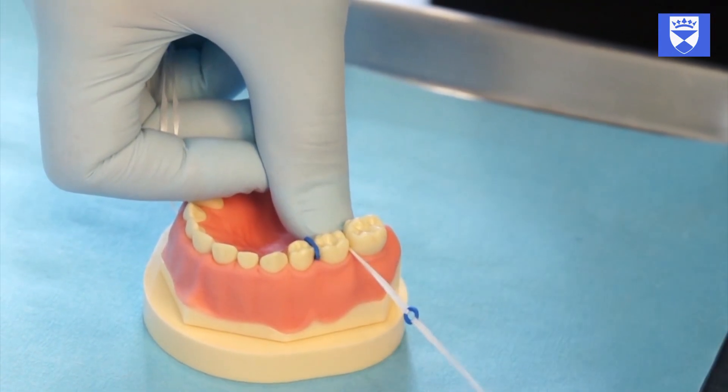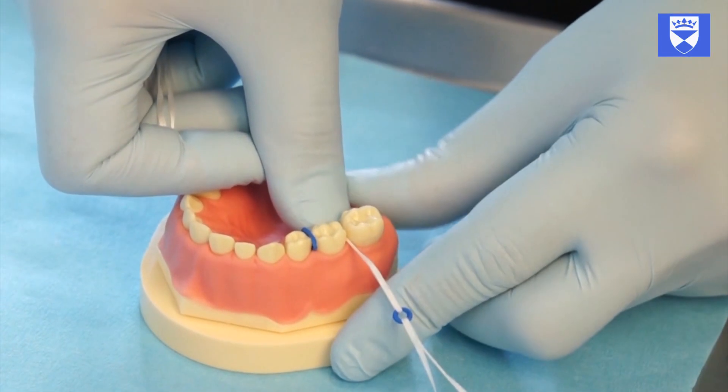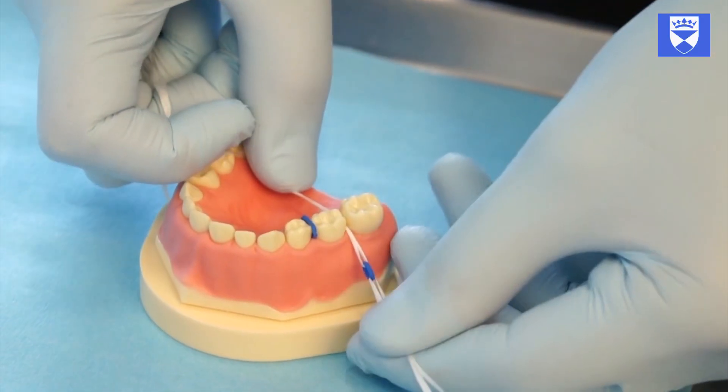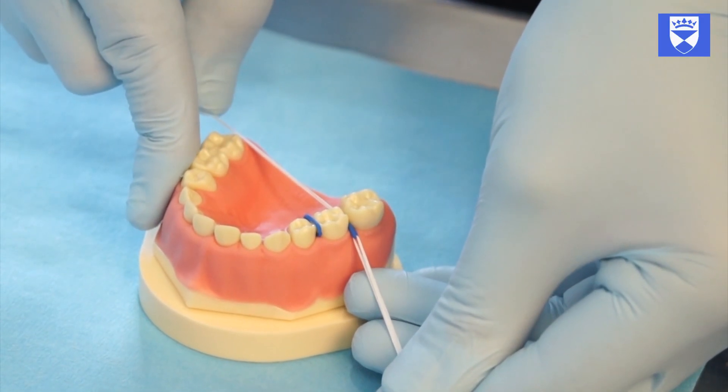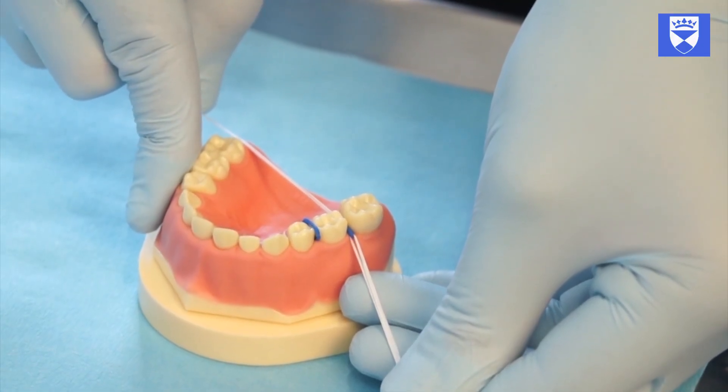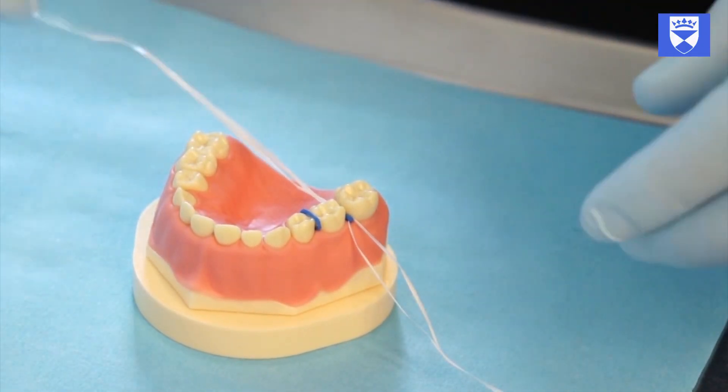An alternative technique of separator placement: pass the floss through the contact point, then drag the separator below the contact point and pull upwards. Pull in the leading edge of the separator through the contact area.